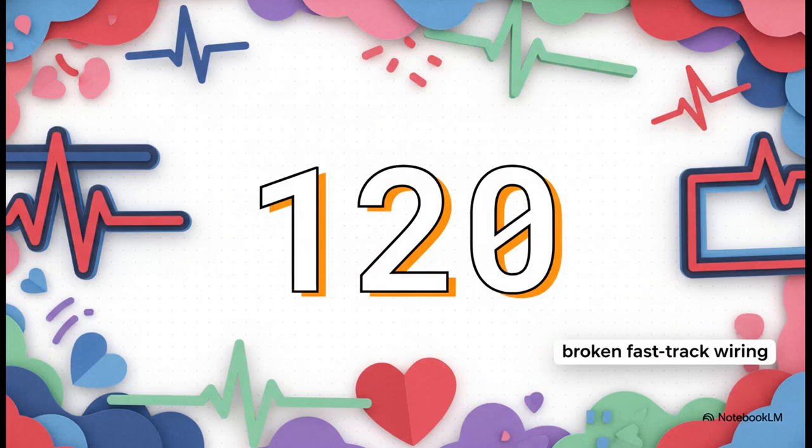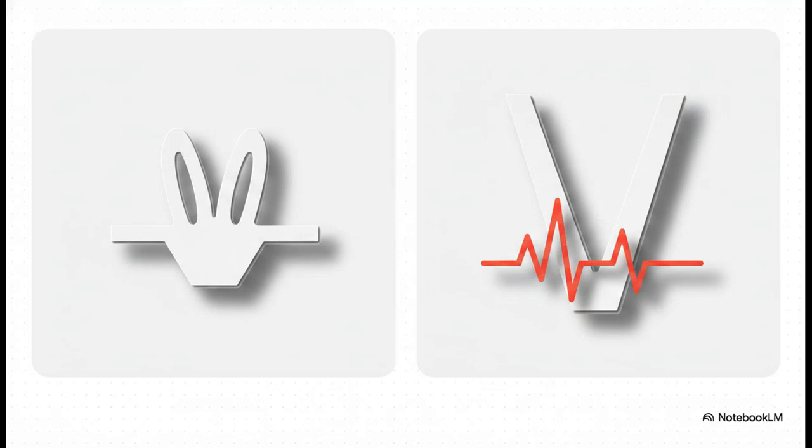120 milliseconds. I need you to lock that number in your brain right now. If the QRS complex, the main spike of the heartbeat, is 120 milliseconds wide or wider, the heart's normal fast-track wiring is broken. You are officially looking at a complete bundle branch block. Notice how a right bundle branch block gives us that distinct extra upward spike in lead V1, known as the RSR pattern.